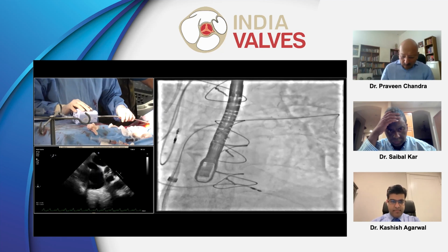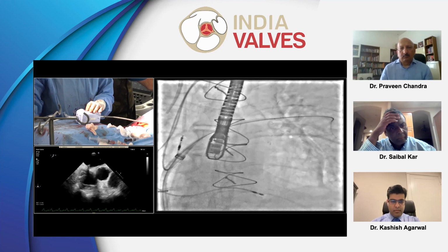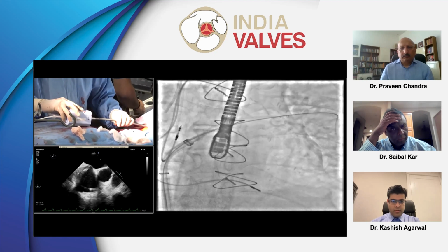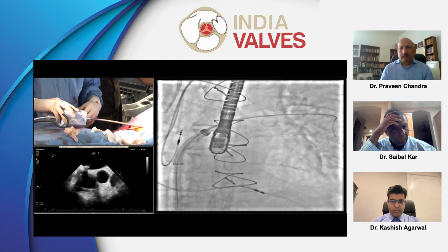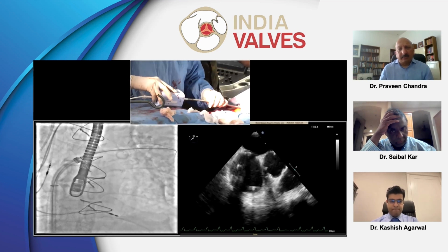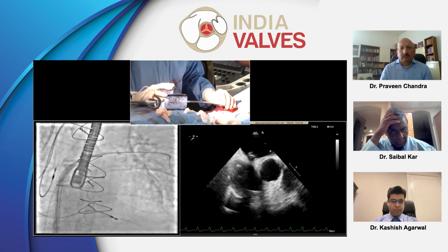Okay, give me a rail. Pull the wire back a little bit. Okay, right there. Hold it like this. So just pull the wire back. Okay, so Prashant, short axis. And then the other question is, do you dilate the septum before going with a guide, or there it jumped in? No, we almost never do. Almost never. No need to. We have the same habit of dilating the septum, but there is no need to dilate. So the guide is in. Prashant, can you measure the guide, please?